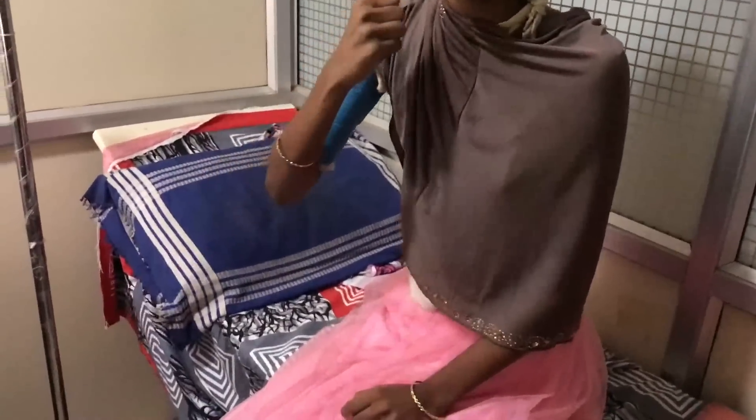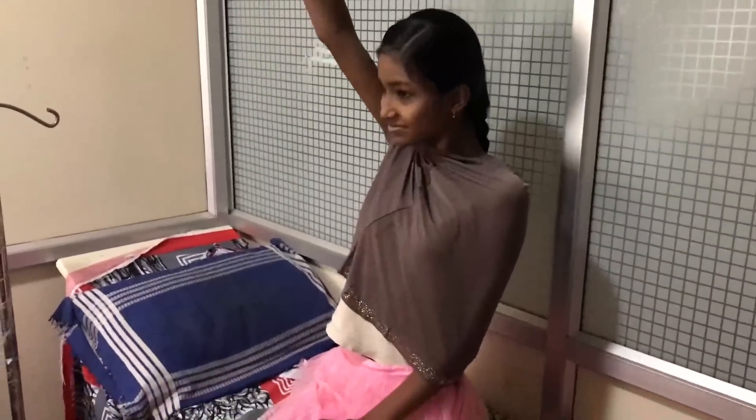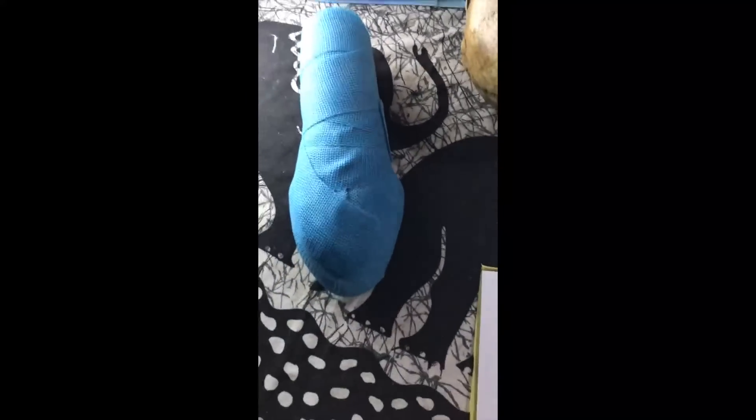Finally, we cut and remove the cast by sliding it out, and you can see the full movements of her hand, wrist, and elbow. This is the piece of cast that was used.